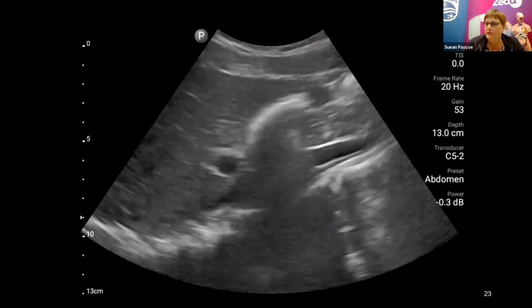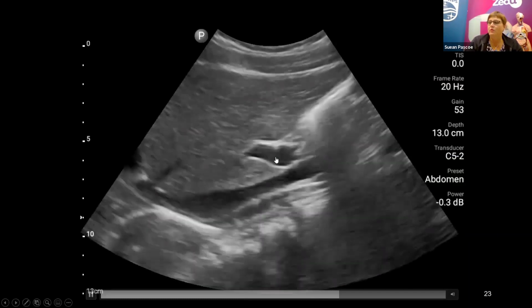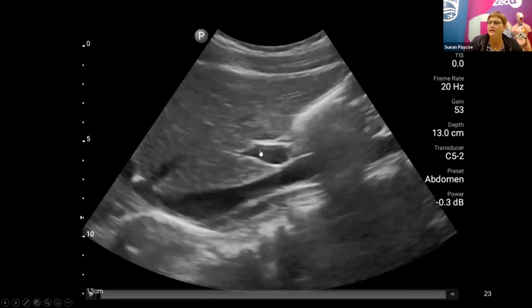So we've got some videos. If we focus here on the portal vein, and as we rotate to lengthen it out, you can see the bile duct coming over the top here.